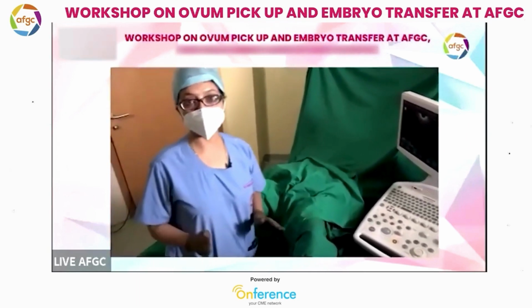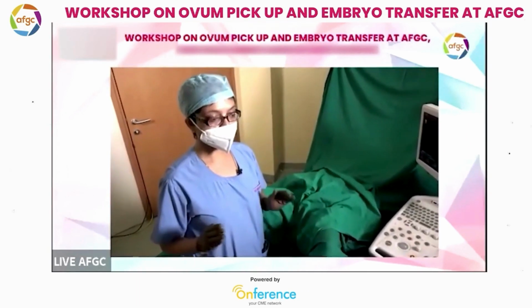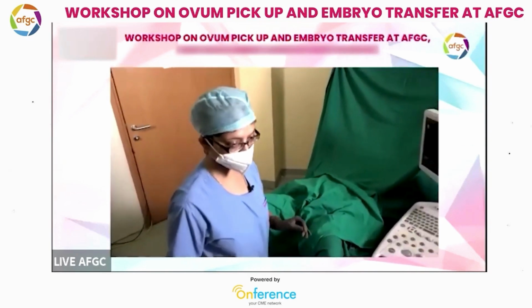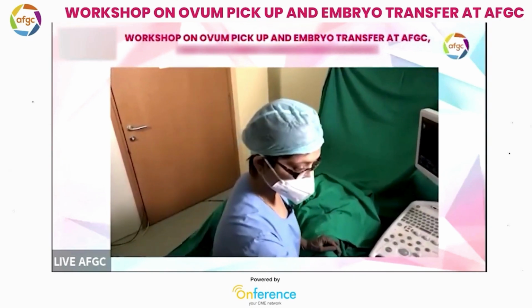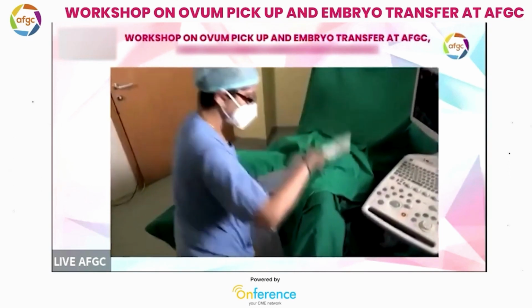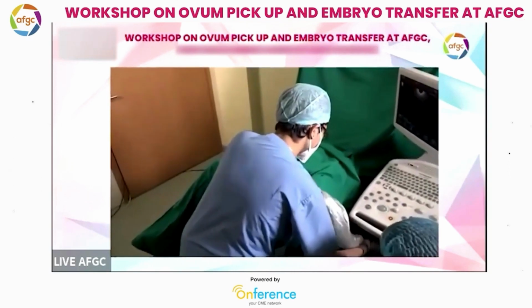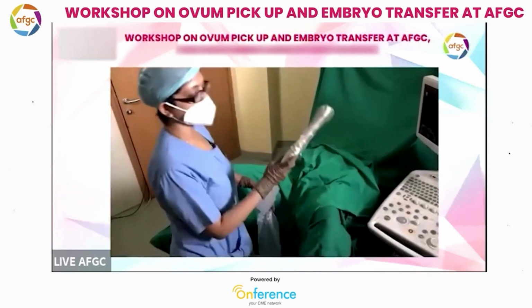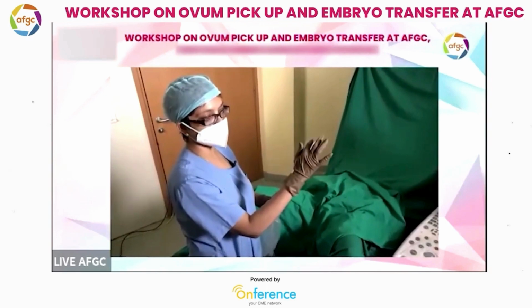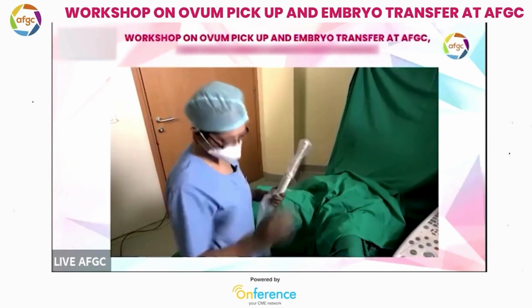Insertion of the probe is very important. We must be very gentle while putting in the probe. So we have used a non-spermicidal cover, and we have used normal saline for lubrication.